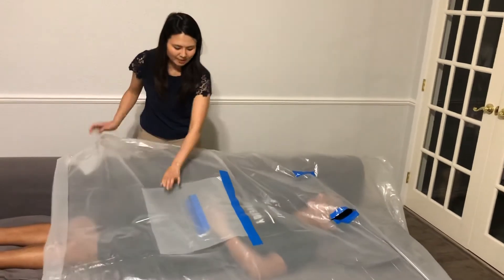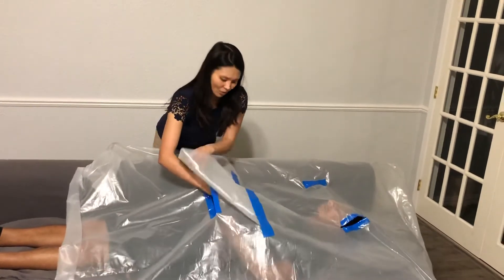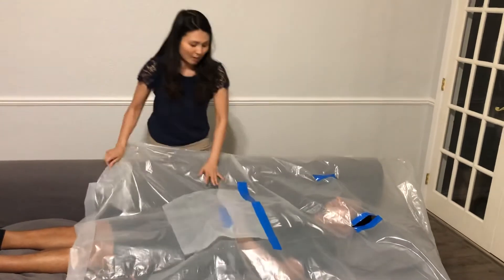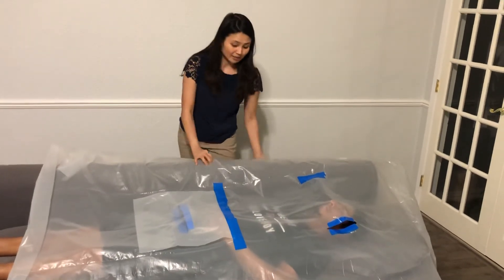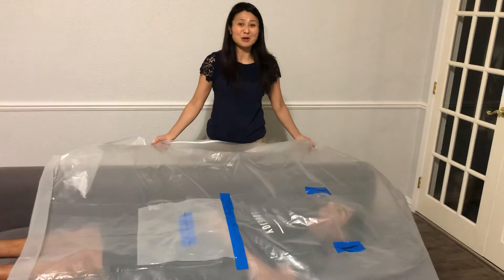So then if I'm the assistant during the intubation, I can stick my hand through the middle hole, cover up the flap, and then place cricoid pressure over the trachea. If the patient is coding and needs CPR, you just do CPR right over the cover. And that's all that's needed to use this sheet in case of a coding COVID patient.